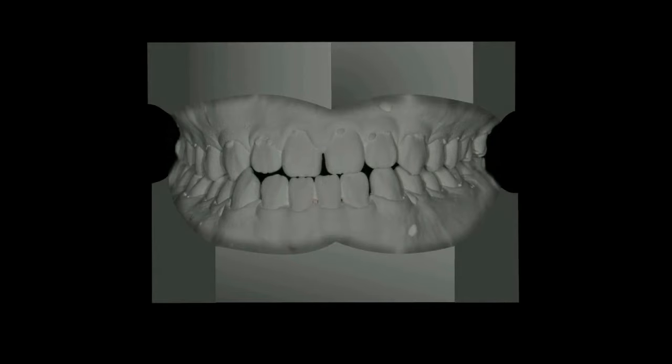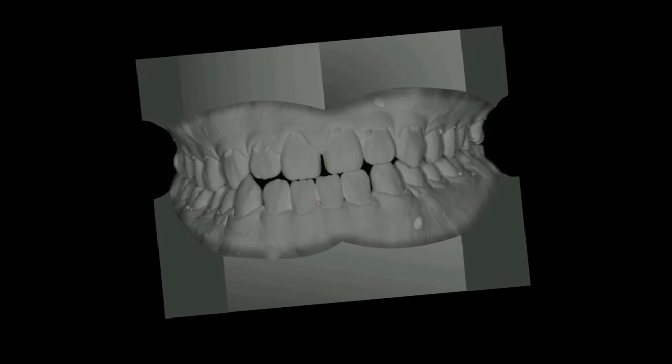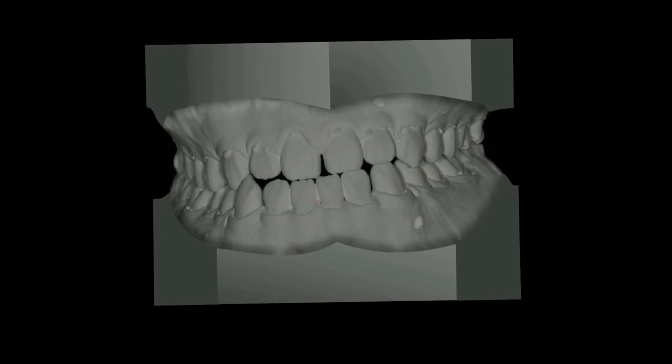This is trimmed model, but this would not be correctly representing the cant of occlusal plane. We could take the model in our hands and rotate them, so that the model should be trimmed somewhat like this to visualize occlusal plane canting.